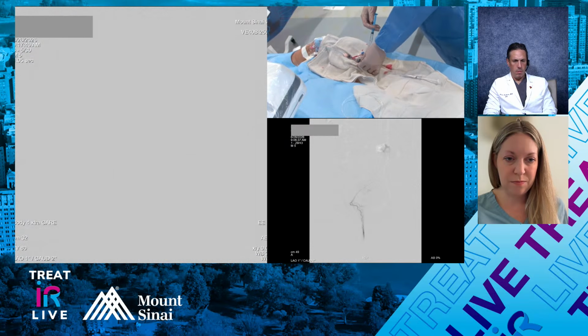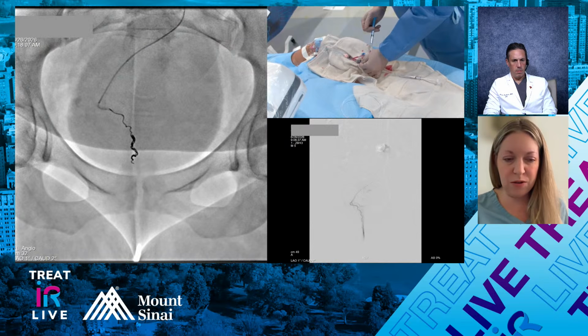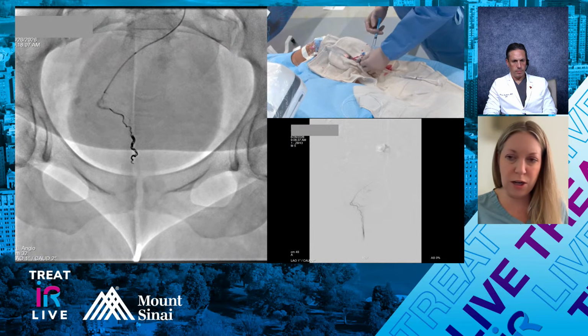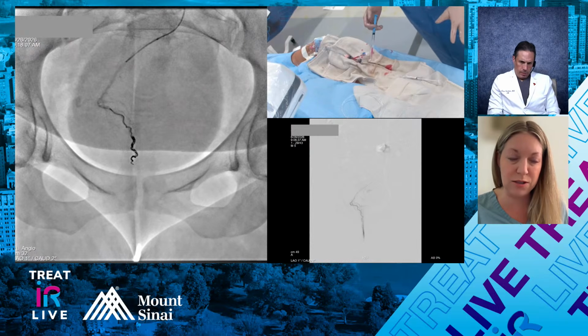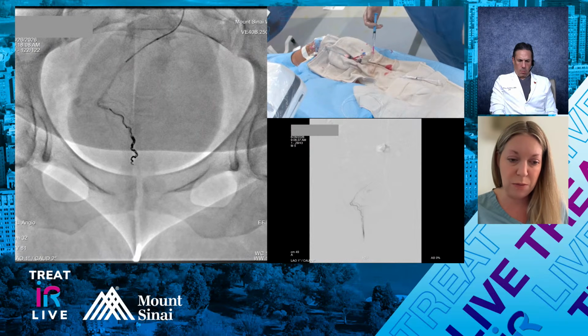3 to 6 number for vessels to treat. Yeah, I think we're usually in that range, but I do think you have to check above that little bifurcation of the superior rectal after you embolize a couple. Sometimes you'll see additional ones pop up that are supplying the CCR. So I think checking after you do your main initial branches that you've selected for embolization is important too.